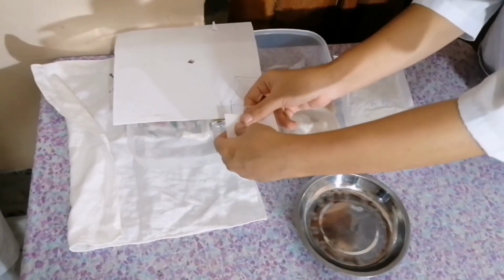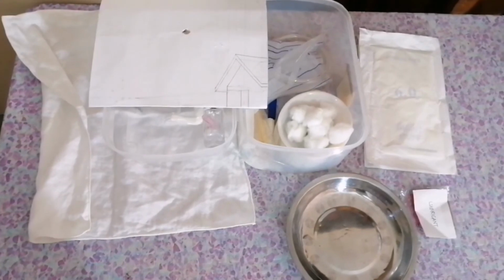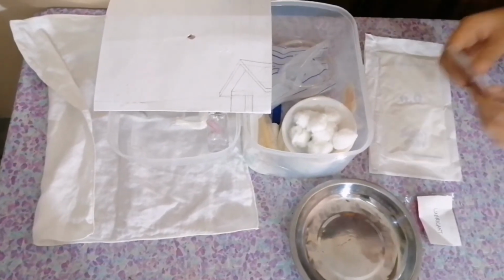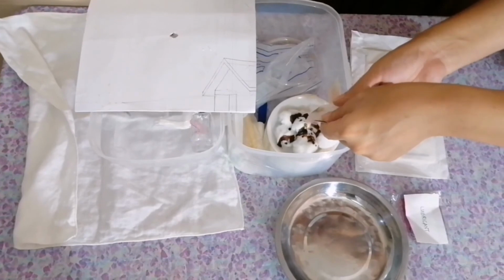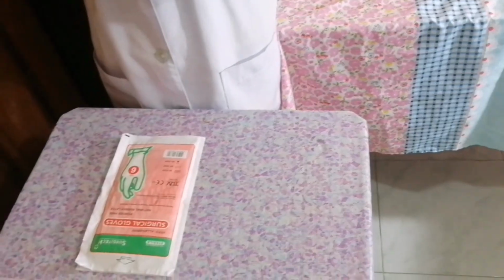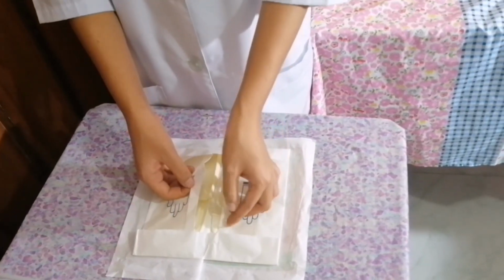Next is to squeeze a small amount of lubricant over the sterile field. Then after that, get 2 cotton balls from the pack and place them on the sterile field. Then pour the betadine over them. Then after pouring the betadine over the 2 cotton balls, put on the sterile gloves.